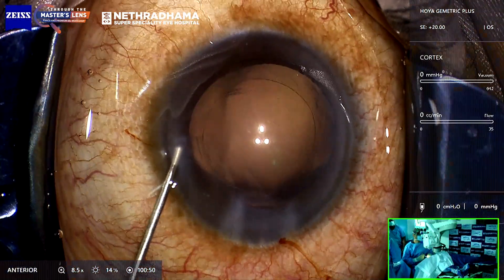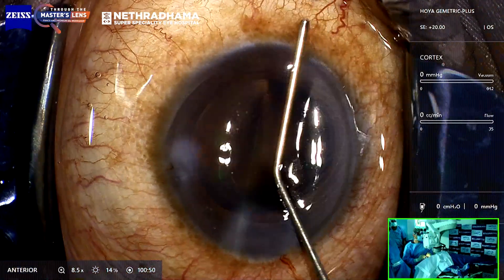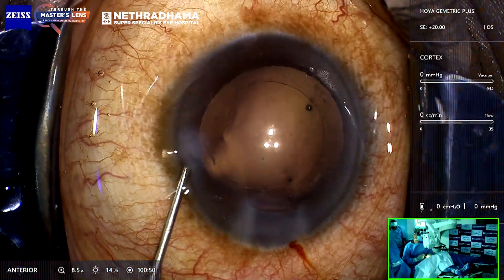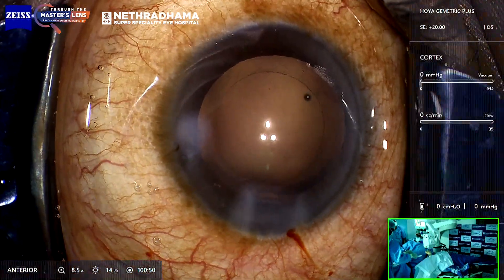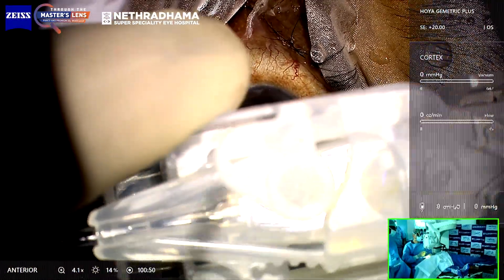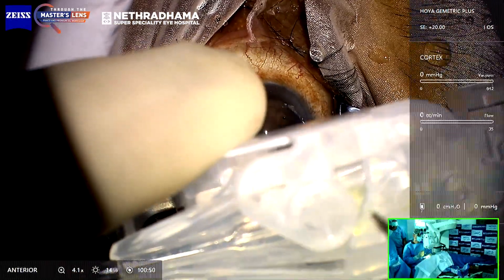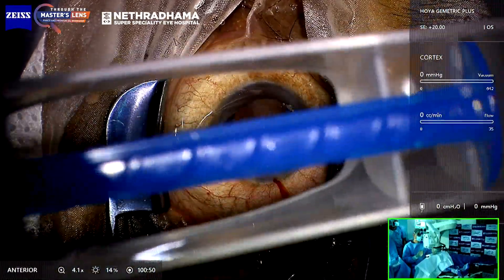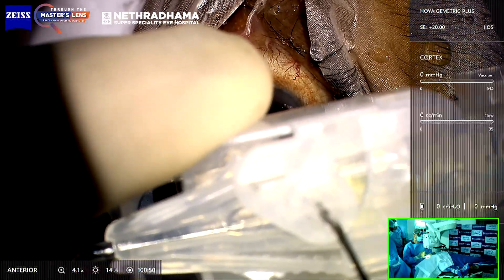If your incision is perfect, as you hydrate the side port you can see the pressure is maintained and the AC is formed very well. This is the Hoya Geometric Plus, which has a differential light distribution — the Geometric has more light distribution for distance, the Geometric Plus has more light distribution for reading. This is the best-in-class injector from Hoya called the multi-sert.